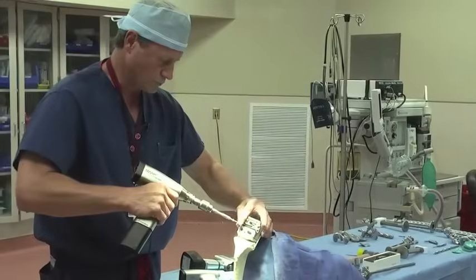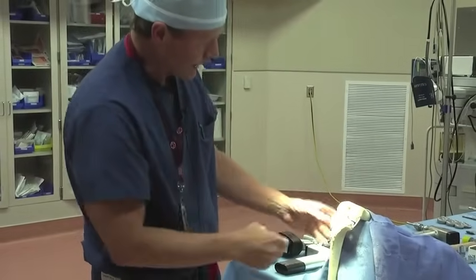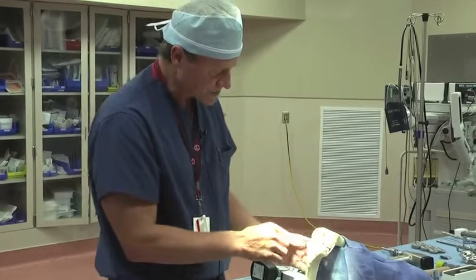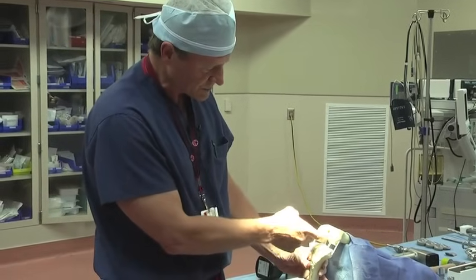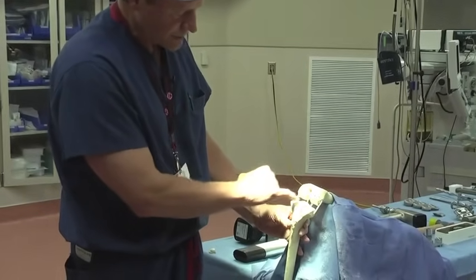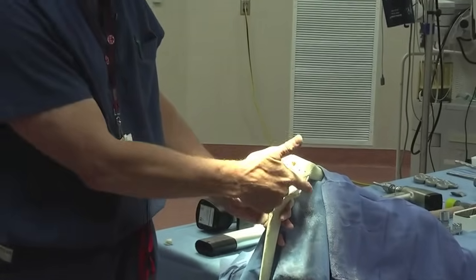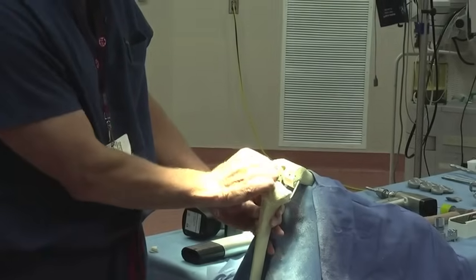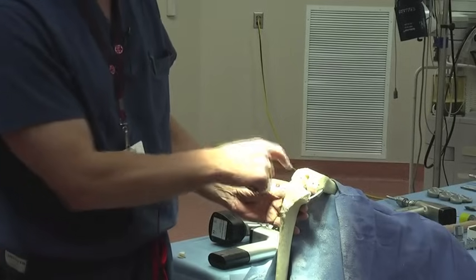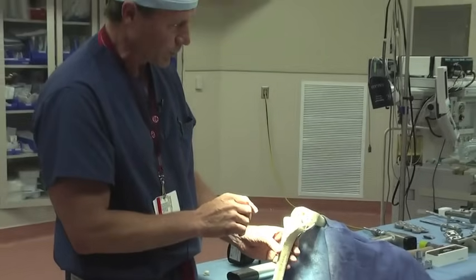The next step is to remove the pins. After we've removed all the bone — and at this point any excessive spurs on here will be taken out as well — we address the ligaments. This represents the posterior cruciate ligament, and the anterior cruciate ligament comes up in this direction. We would go ahead and take those two ligaments out with this particular implant, leaving our collateral or side ligaments, represented by these bands right here. We would also remove any remaining meniscal or cartilage tissue. At that point, we've got the femur prepared where we want it.